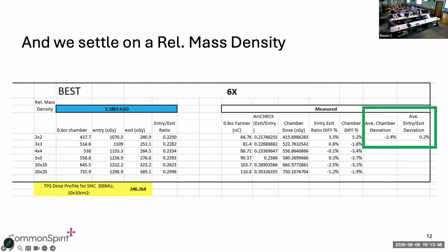The next step would be, okay, what is the dose at that depth? SNC recommends going to a depth of 2.9 or something like that, and doing it on either a flat phantom or a curved phantom, it doesn't matter. But what I would recommend is to actually export. So you do your density override, export the plane to your ArcCheck software, and then look at the dose in the ArcCheck software. Then just hover over the center 2 diodes or center 4 diodes, wherever you're trying to look, and use that number to calibrate your dose.